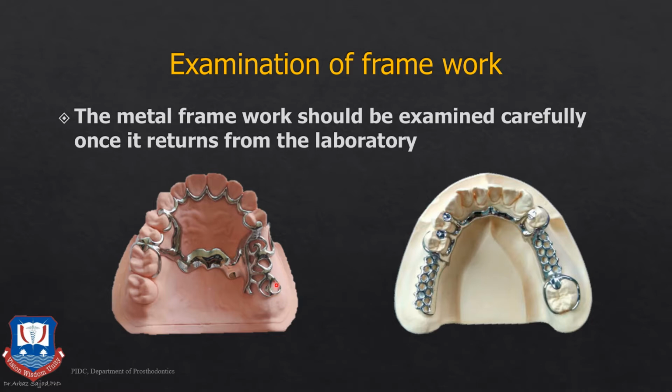So here we see a CPD framework for a Kennedy's class 2 situation for the maxilla and the mandible with a modification space over here. It is first fixed on the model, and we check for intimate fit of the major connector, the minor connector, and the rests on the rest seats on the model, and they should be flush against the tooth surface and the tissue.